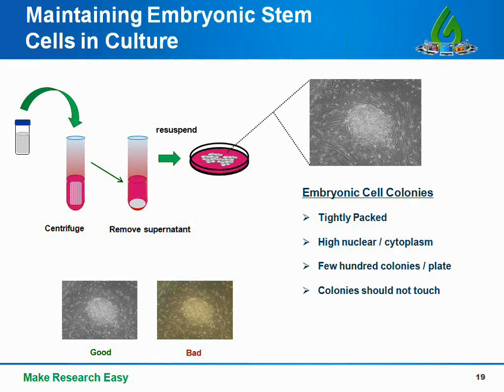Now, once the embryonic cells are plated, it is important to change the media frequently. I can't stress this enough. A safe bet is to change media every day. Also, you don't want to let your embryonic cells become too confluent or remain in the same culture dish for too long.